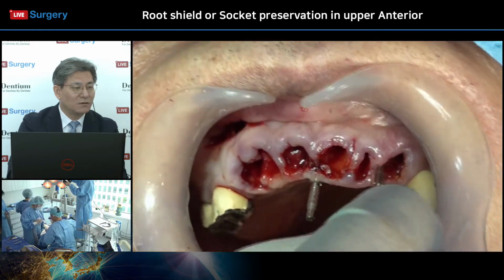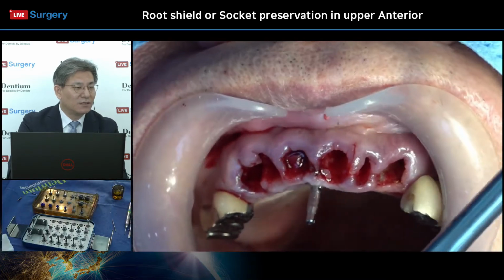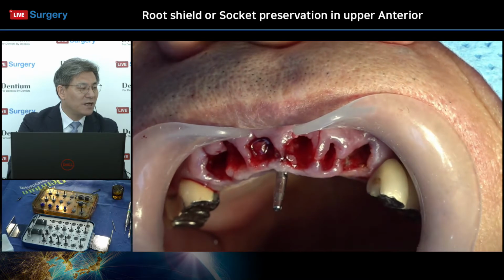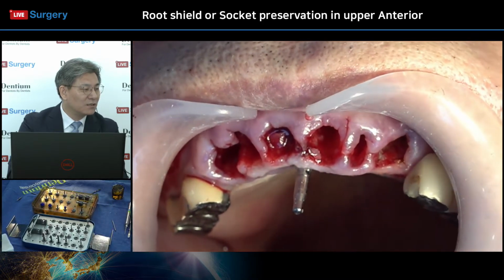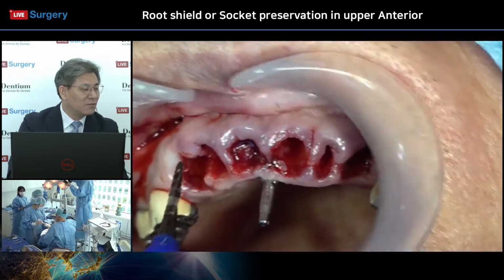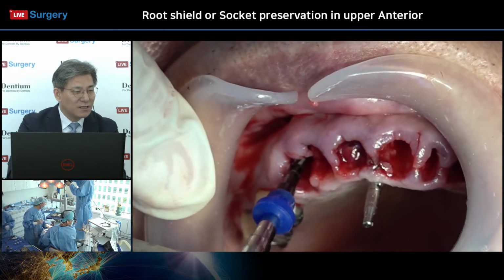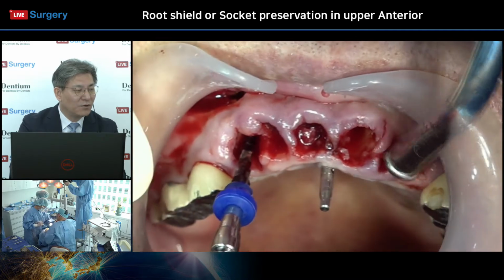Yeah, all of the prerequisite treatment was done. So now it is time for implantation, the placement of the implant fixture. Today, Dr. Chung is using the guide kit and the Bright implant system. This guide kit has a blue ring, looks like here. 7 millimeters. Can you see the 7? It means the diameter of the blue ring.